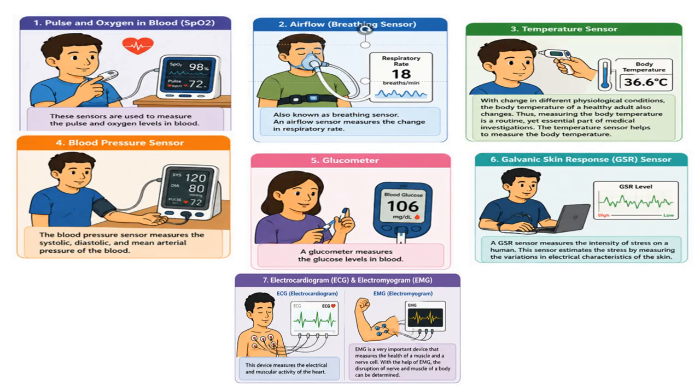In healthcare IoT systems, wearable ECG devices continuously monitor heart activity and transmit data to healthcare providers in real time. This allows the doctors to track a patient's condition remotely and respond quickly to emergencies. So continuous ECG monitoring will improve early disease detection, support preventive healthcare, and enhance patient safety through timely medical intervention.